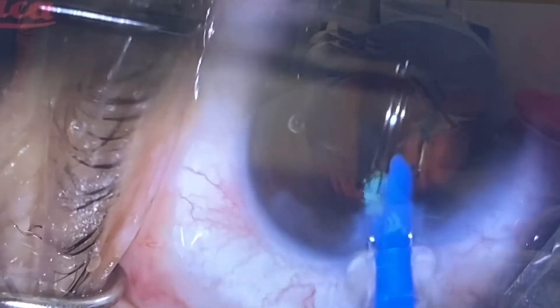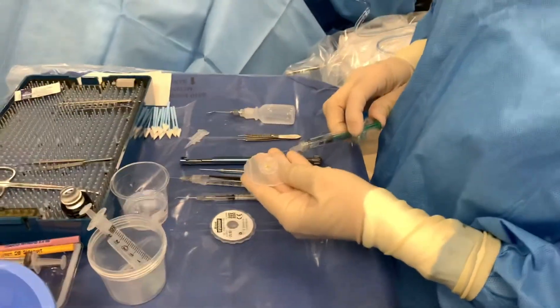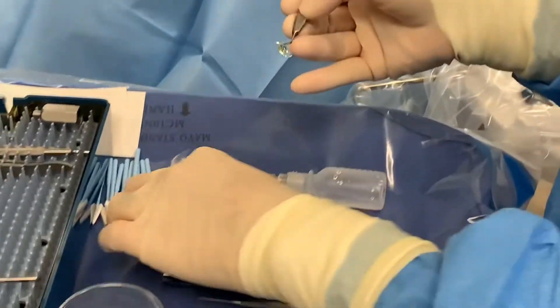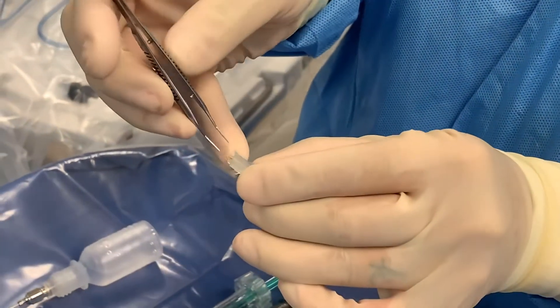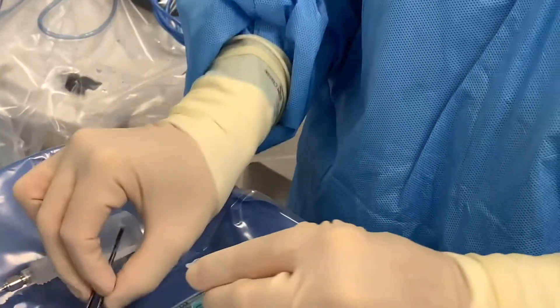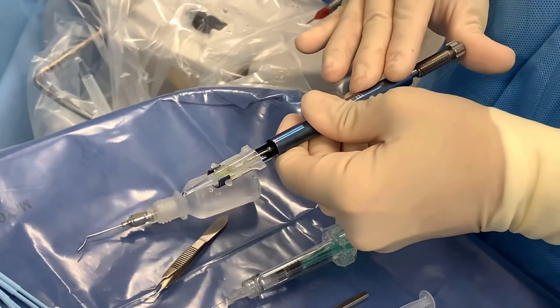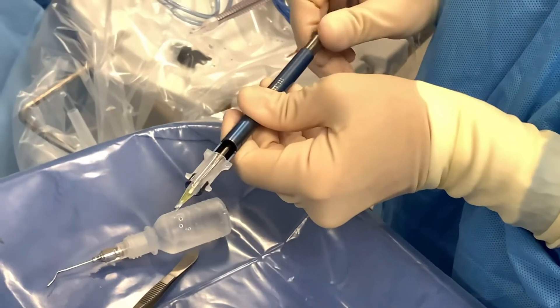One of my favorite aspects of the new Clarion lens is that it's preloaded. Here's some video footage of what our surgical technologists had to do in the past with the older delivery system. It took a lot of meticulous care to fold it up, place it into the cartridge, and then load the cartridge into the delivery system. You can see that there's potential for scratching the lens, bending the lens, or damaging the lens before our surgical technologist gives it to the surgeon.